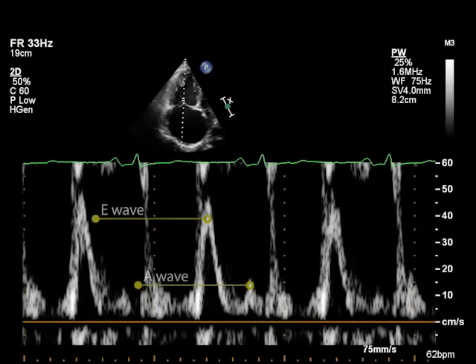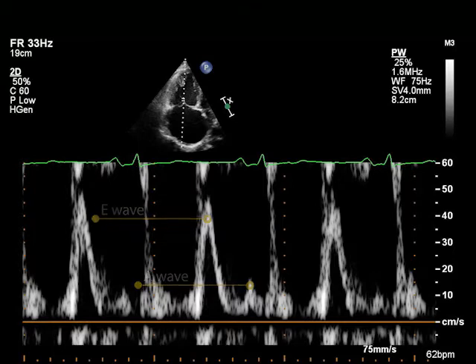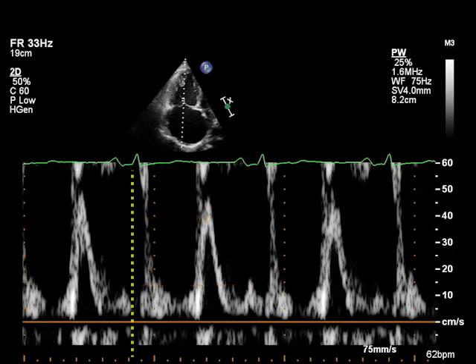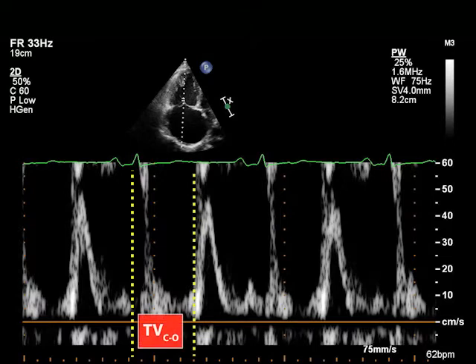In this view, the tricuspid valve closure to opening time, or TVC to O, is calculated as the time from the end of the transtricuspid A wave to the beginning of the transtricuspid E wave.